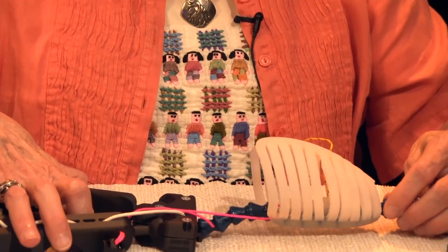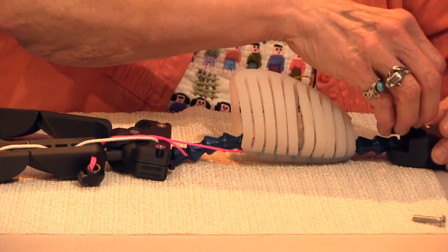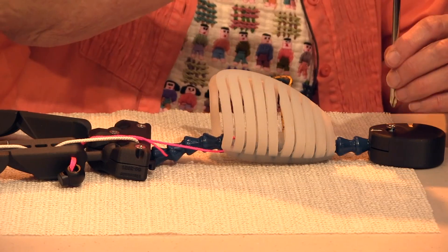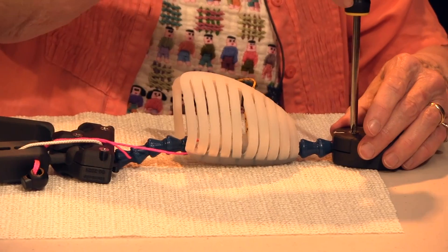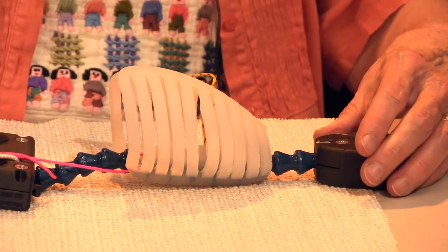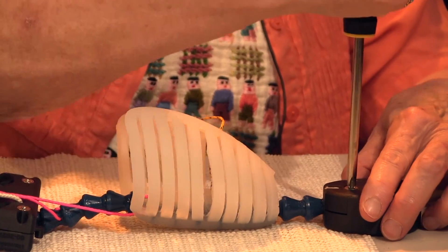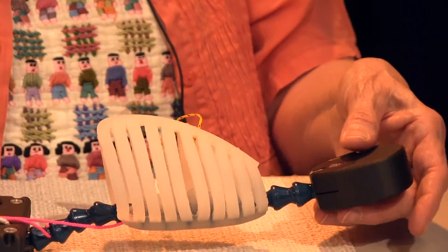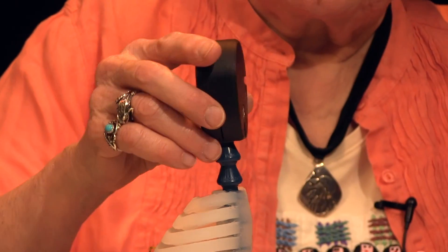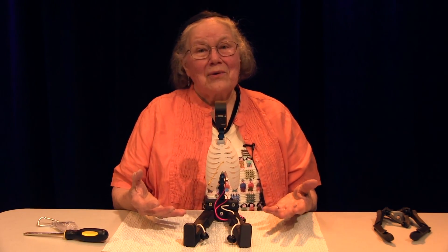Lay HAMI flat again, replacing his head. Tighten the screw to allow for appropriate head motion so that there's some stiffness to it. Remove the tape. And here he is with his new chest.